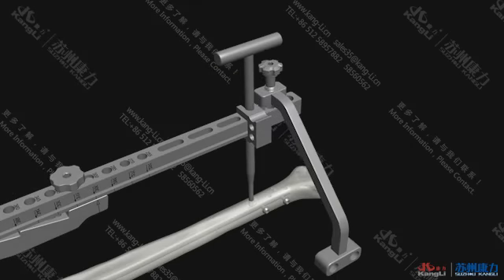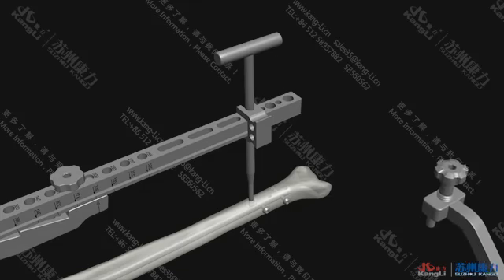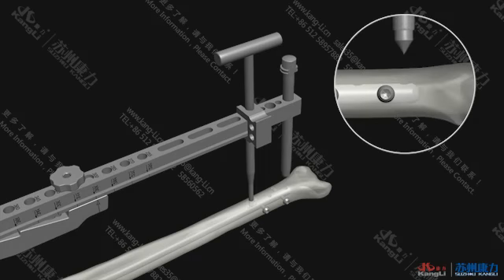The third and fourth 4.5 locking screws could be placed at the front or rear of the nail of the KTO Tibial intramedullary nailing system according to the requirements of the type of the fracture. The operation should be performed as follows. Insert the soft tissue separator and outer sleeve at the front and rear position of the distal end of the guide bar. After a 0.5 cm long incision is made right under, continue inserting the soft tissue separator and outer sleeve until bone cortex is reached. Remove the soft tissue separator. Insert the 4.0 inner sleeve and 4.0 pin to drill.